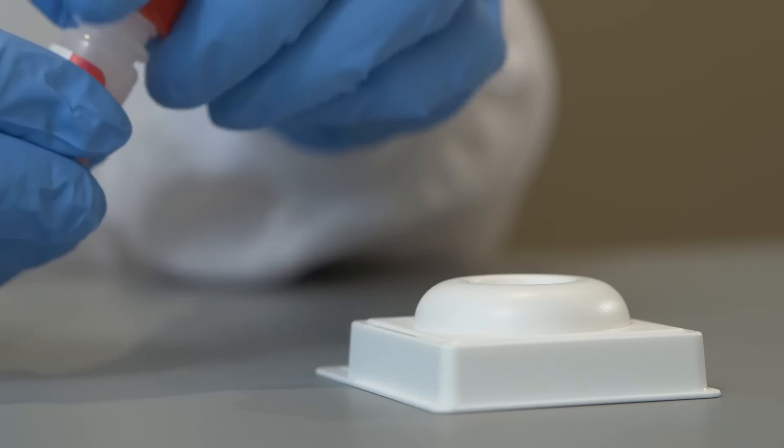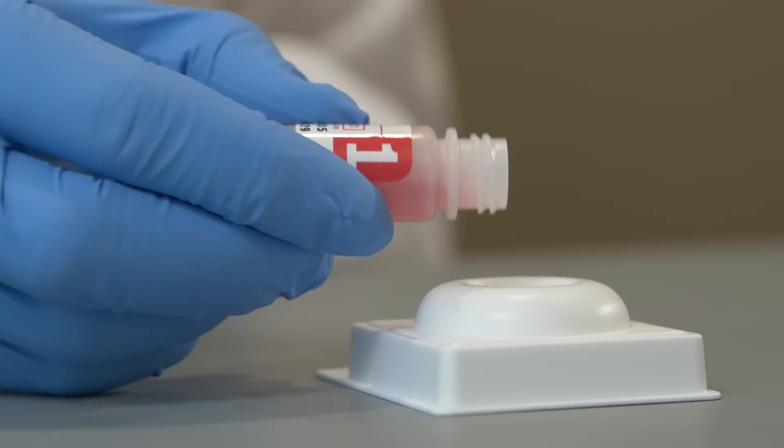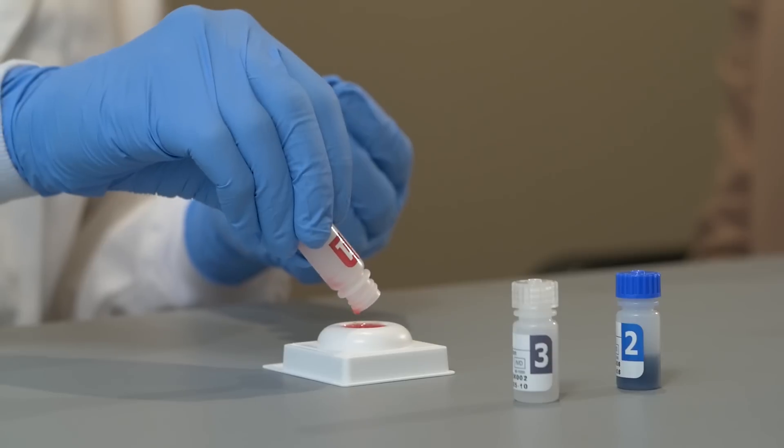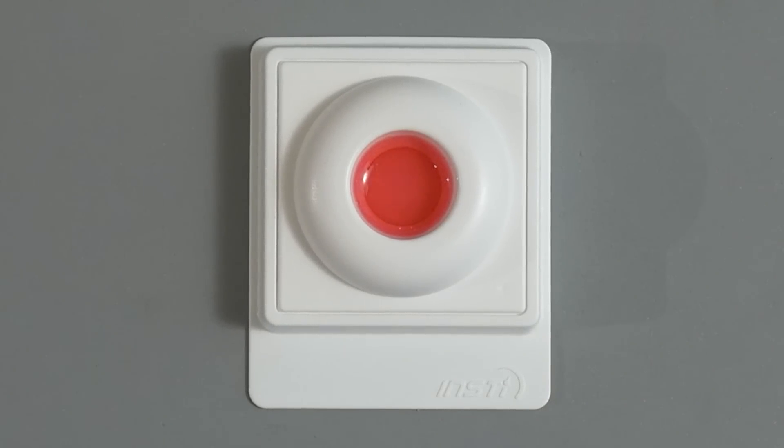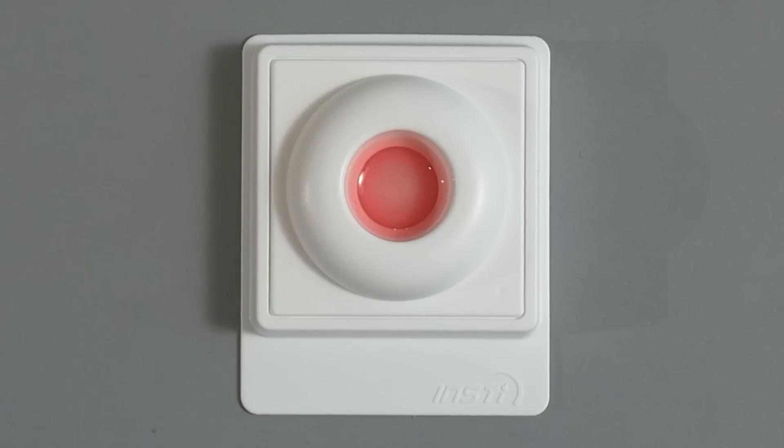Open the sample diluent and pour the entire contents into the centre of the membrane unit well. The sample should be absorbed quickly. Wait for all the liquid from bottle number one to be absorbed completely.